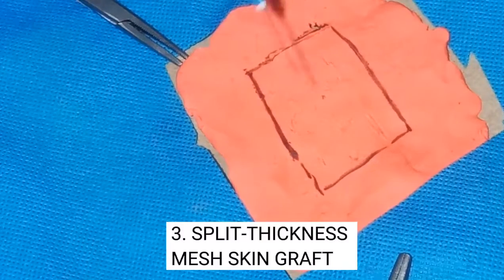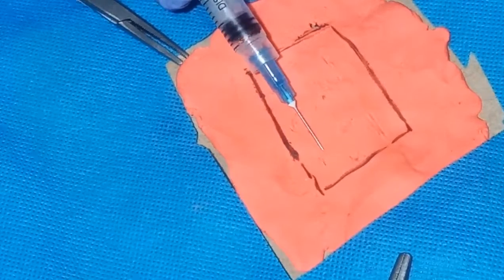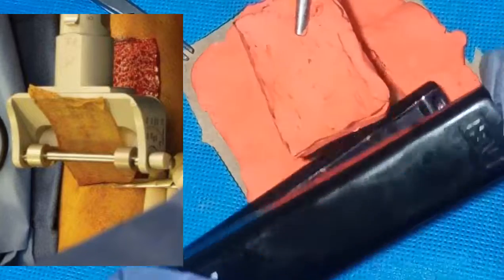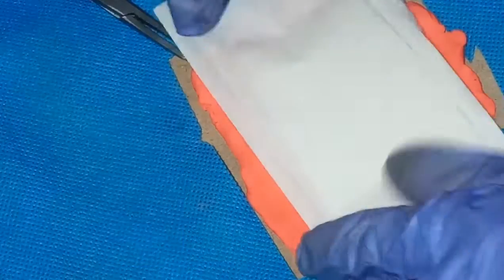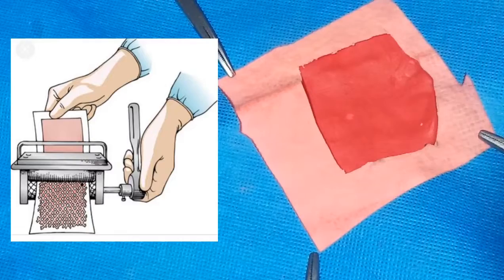So, aseptically prepare the donor and recipient sites. We are doing infiltration anesthesia. Estimate the size of the wound by measuring or cutting out a template using a sterile drape material. After that, we sharply excise the donor skin from an area of thin and redundant skin. Avoid excising the subcutaneous tissues. Lavage the skin frequently with sterile saline.